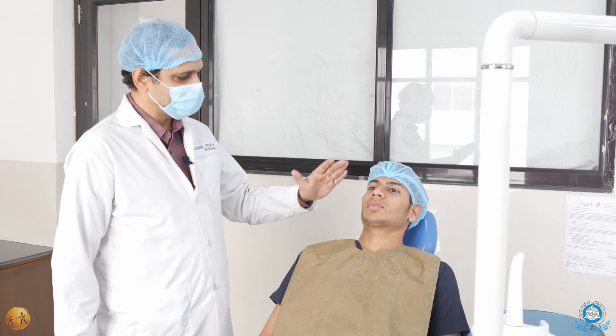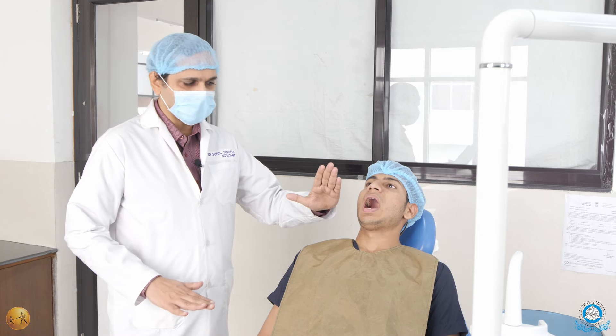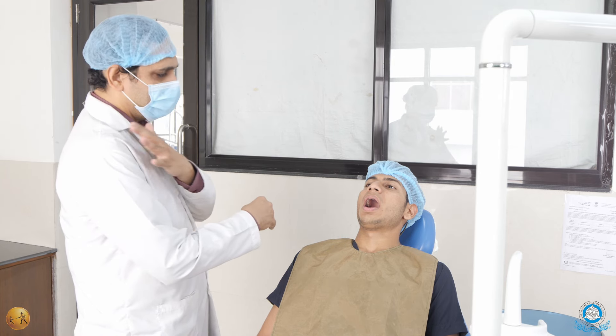For the maxillary extraction, keep your head rest positioned correctly. The maxillary occlusal plane, when the patient opens the mouth, should be at 45 degrees to the floor, and the occlusal plane should be between the elbow and the shoulder level.